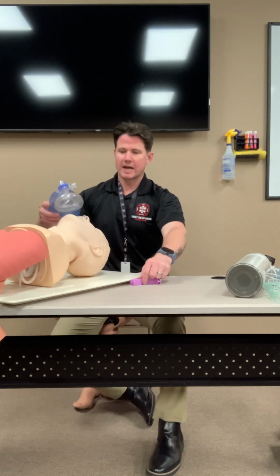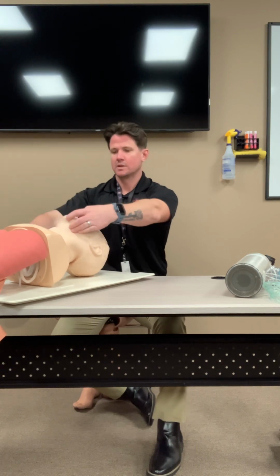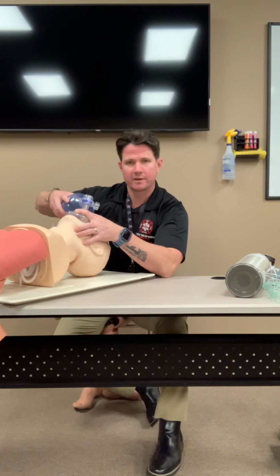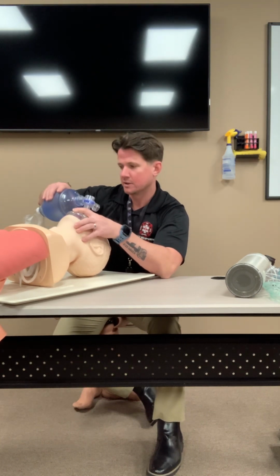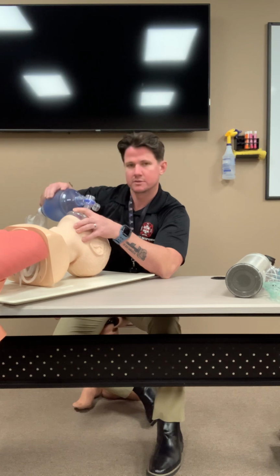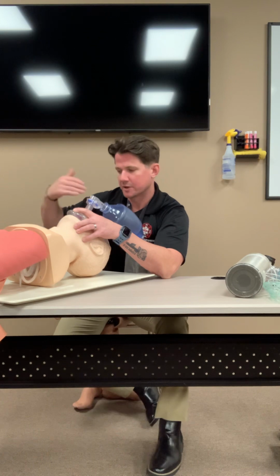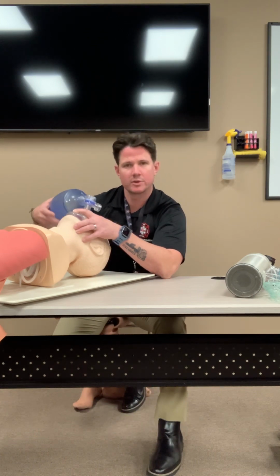So once you get your adjunct in, right, NPA or OPA, you're going back to bagging, okay? Rescue breathing for an adult is 1 breath every 5 to 6 seconds, right? So 1, 2, 3, 4, 5, 6, 7, 8, and so on and so forth. You notice you're counting out a real 5 to 6 seconds, right? We don't want to be too fast. We don't want to be too slow.